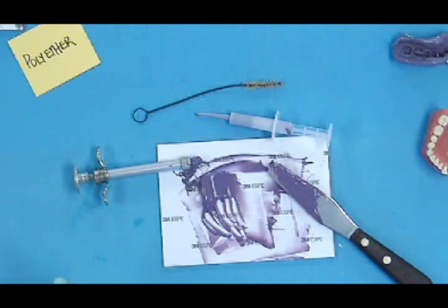And this is the type of material you might see in your office. On page 256 in your textbook, there's a machine called an automix, and you basically have two large tubes of the polyether inside the machine.